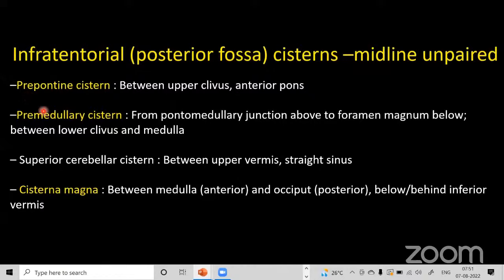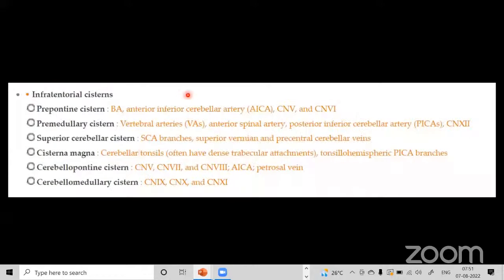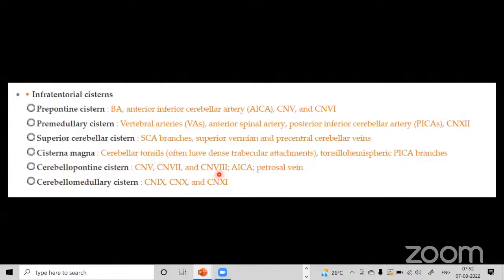The important infratentorial cisterns are midline unpaired single cisterns: prepontine, pre-medullary, cisterna magna, and superior cerebellar cistern. Their contents are: prepontine — basilar artery, cranial nerves 5 and 6; pre-medullary — vertebral arteries, anterior spinal arteries, PICA, and cranial nerve 12; superior cerebellar cistern — SCA branches; cisterna magna — cerebellar tonsils. The cerebellar pontine cistern contains cranial nerves 5, 7, and 8. The lateral cerebellar medullary cistern contains cranial nerves 9, 10, and 11.